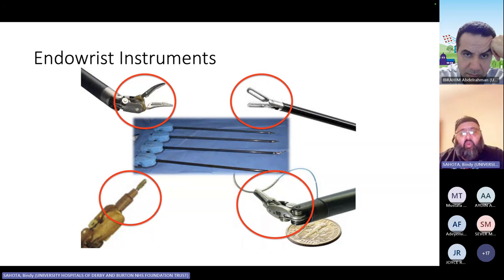That's why the robot is really good at getting around those corners. Yeah, and I find this a lot easier than the laser. It's funny because I'll do tongue-based resection with a robot, but I won't do it with a laser because I find it so difficult. That's just because in my hands, I've done two robotics fellowships, and that's what I've learned over that time in Newcastle in the UK and the Royal Adelaide Hospital as a combination.